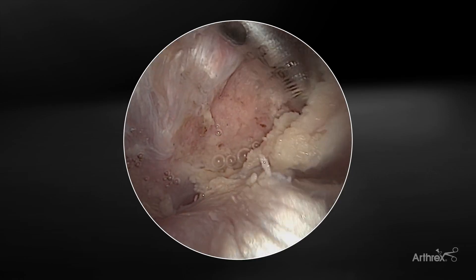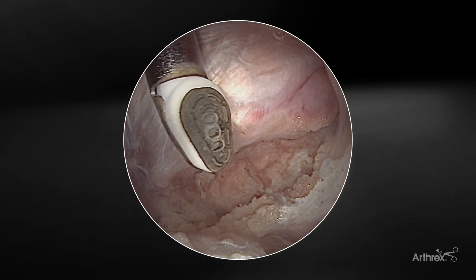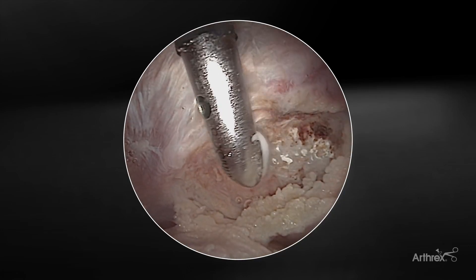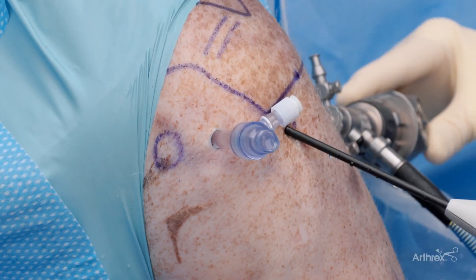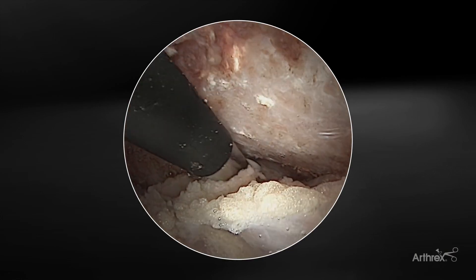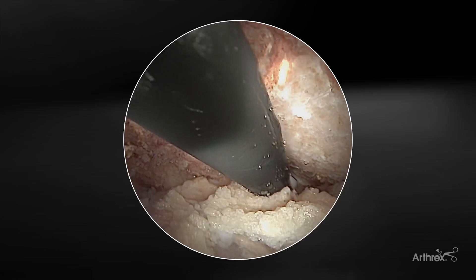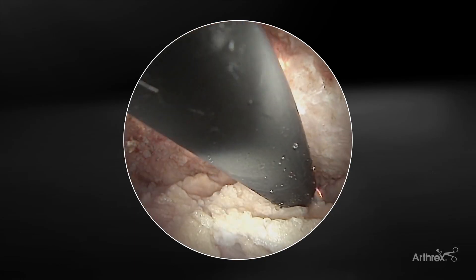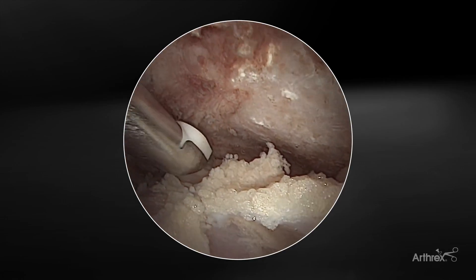It does a really nice job of releasing tissue off the acromion. If you look at the face of the device, there are three large aspiration ports. The beauty of that is there's a fair amount of aspiration as you activate the device, which does two things: number one, it minimizes the amount of bubbles; and it also really reduces the risk of clogging. As we work medially back to the acromial spine, you can see it just kind of peels off the tissue, allowing for mobilization of the bursal-sided fibers of that rotator cuff. Visualization is clear, minimal bubbles, very efficient at resecting excess tissue. The geometry and tapered tip really allows for ease of passage medially — rarely gets held up or caught on tissue.